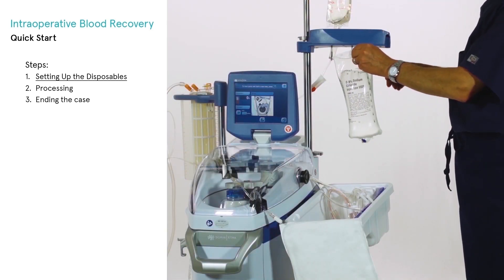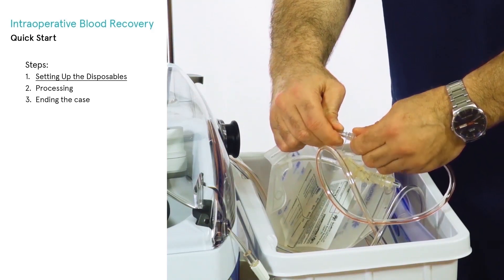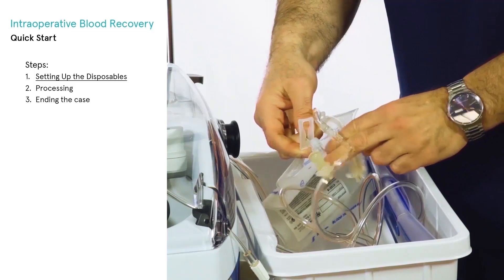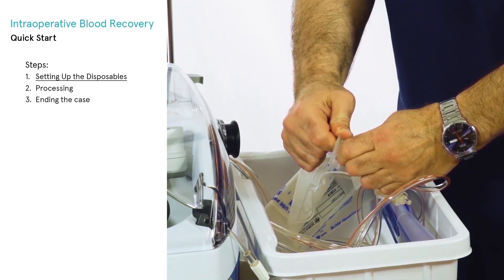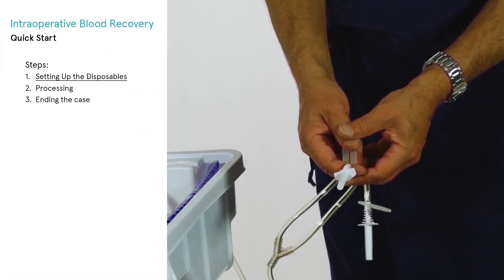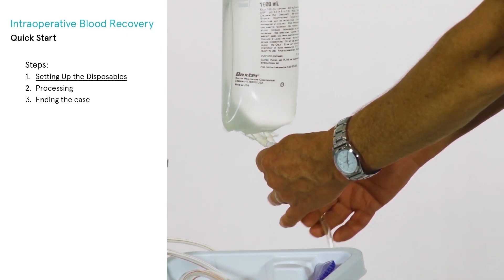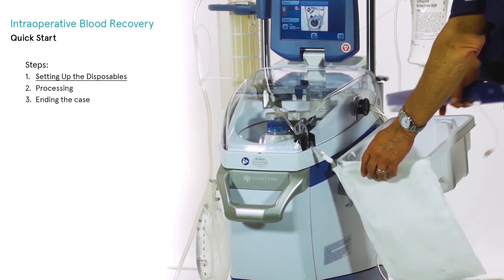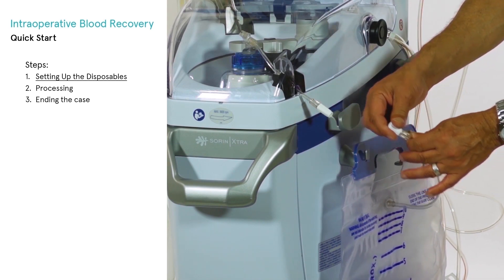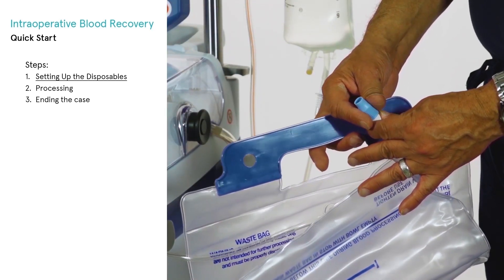Hang the wash solution bags on the hooks provided. Remove the RBC bag from the tray, making sure the connection from the RBC bag to the RBC line is tight, as the connection may sometimes loosen during shipping of the disposables. Close the clamps on the two other lines of the RBC bag and hang it on the upper hanger of the IV pole. Close the slide clamp of one of the two yellow wash lines and spike the wash solution with the line left open. Pull out the waste bag from the tray, remove the tray, hang the waste bag on the two lower hangers, and connect the wasteline to the waste bag. Ensure the waste bag drainage port is completely closed.